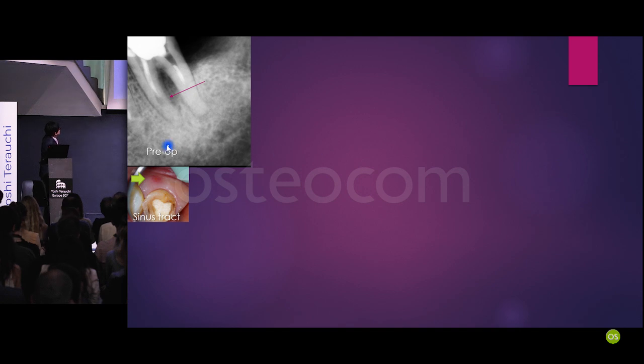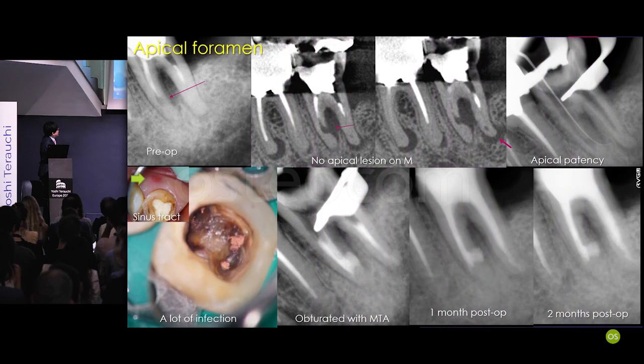Another case, you see no lesion, but you do see furcation lesions. I took CBCT, and I found the apical foramen located on the distal side of the mesial root. There's no apical foramen at the apex of the mesial root. So because of this, I didn't look for the apical foramen at the apex of the mesial root. This saved lots of time.